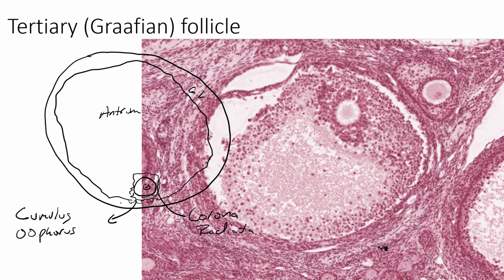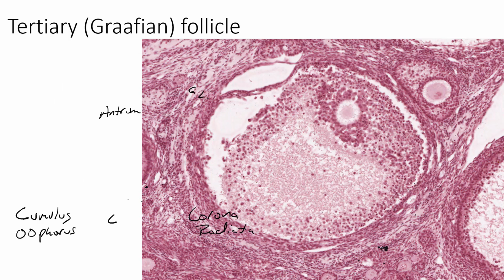If we look at a micrograph, and I'll have to erase my sketch this go around, we're going to label these structures on this actual micrograph, so we don't need my sketch much anymore. Now this one is not sliced through the middle of this Graafian follicle. This is up towards the top, so we're starting to see the top of the sphere, but it's still not bad.